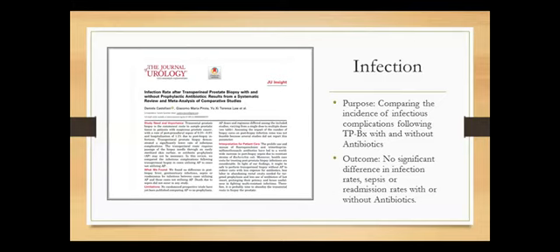So here's a meta-analysis that commented on the infection rate after transperineal biopsy with or without prophylactic antibiotics. The results of this study showed that there was no significant difference in infection rates, sepsis, or readmission rates with or without antibiotics with regard to transperineal biopsy, of course. So it seems like the transperineal biopsy is really safe in terms of it has lower infection rates.